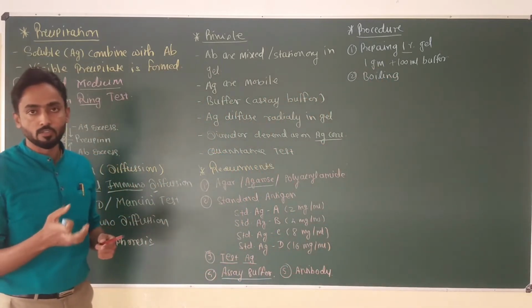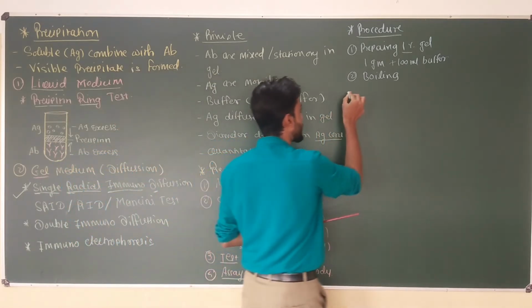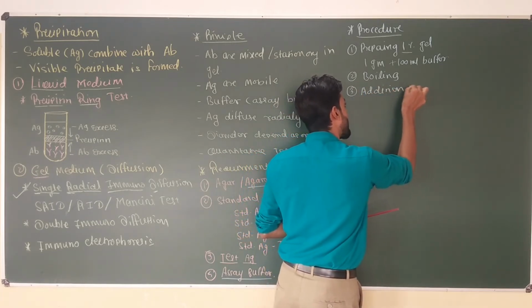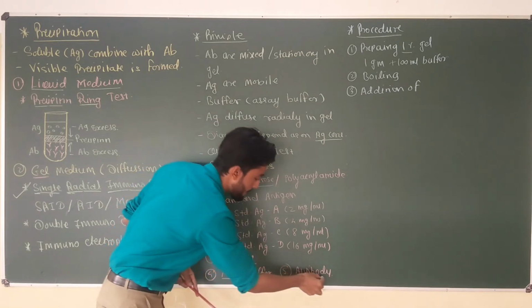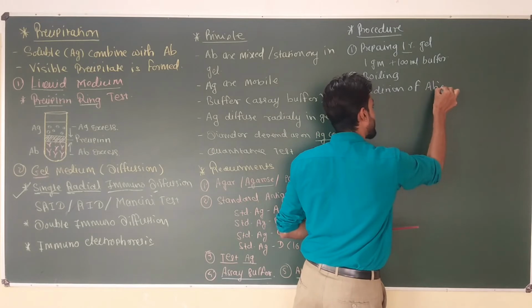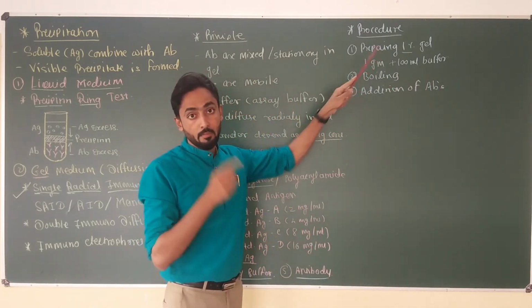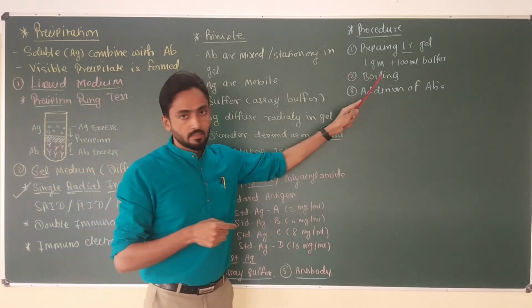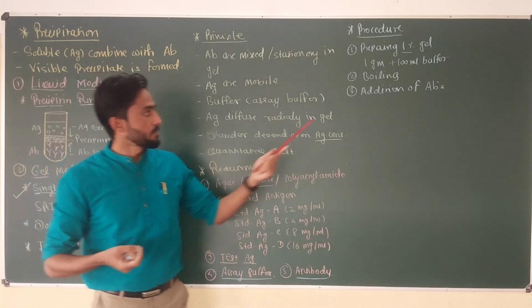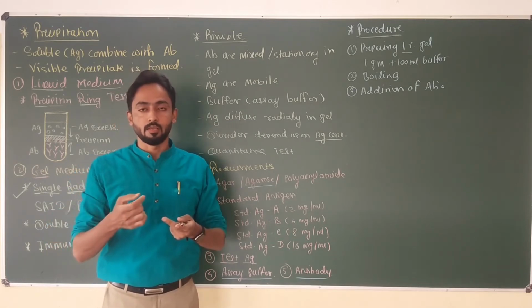After dissolving the agarose, a crystal clear solution will be produced, and then the next step is addition of the antibodies to the molten boiled agarose. Remember that after boiling, the temperature of the agarose solution will be very high, and at that temperature, if you add antibody directly, the chances of denaturation of the antibody will increase.